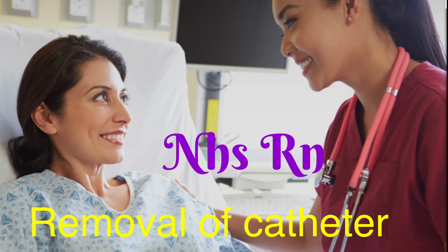So you can say to the patient, hello, my name is this, I am your nurse today, or I am looking after you today, and I'm here to take your catheter out. Then ask the patient for consent, is that okay? The patient would say yes.